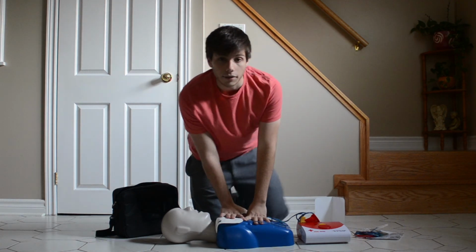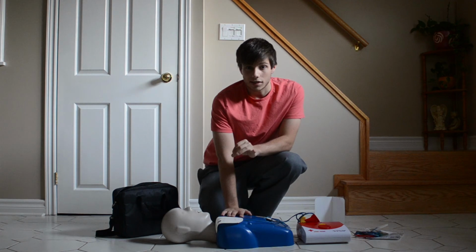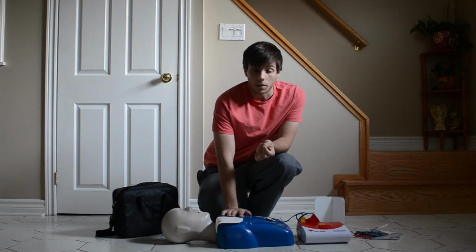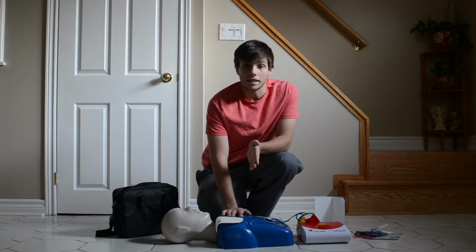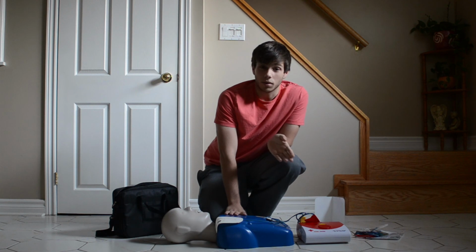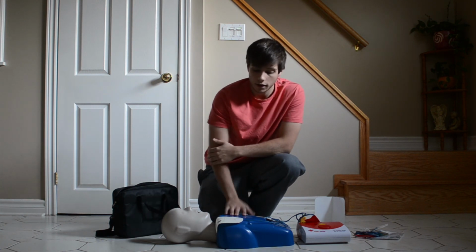Another thing I have to mention is when you're using an AED, you want to make sure that it passes the splash test. If there's any kind of water around, you can get some sort of object like a coin and throw it in, and if it doesn't splash, you are fine. You can use an AED. If you throw something down and it splashes, and this is directly touching the person, you would want to move the patient as well, because you wouldn't want to shock yourself and anyone else around.